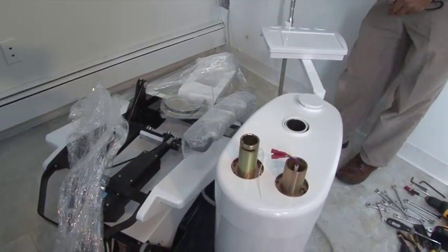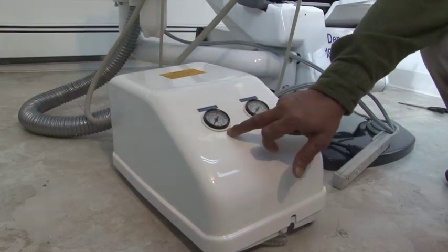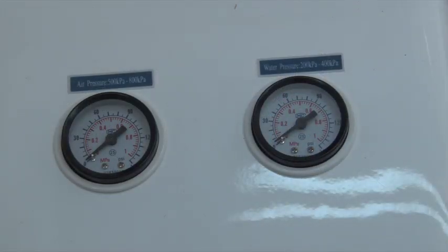Remove the protective plastic covers of the high and low suction tubes and place them on the assistant tray. Then remove all the remaining protective plastic covers. Identify the water and air pressure gauges in the junction box.